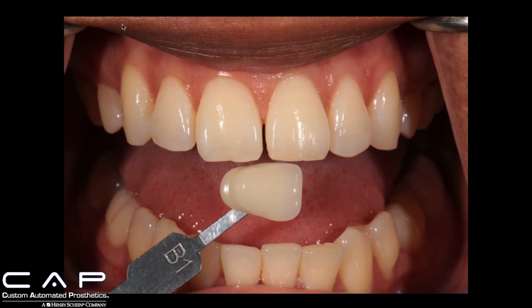So here's a picture of the B1. It's a little low value. A lot of people think that B1 is the brightest shade in the shade guide for the Vita Classic. It's not. A1 is actually the brightest. Some people say it's actually D2 or B2, but it's not. A1 has the highest value and is the brightest shade to choose from.